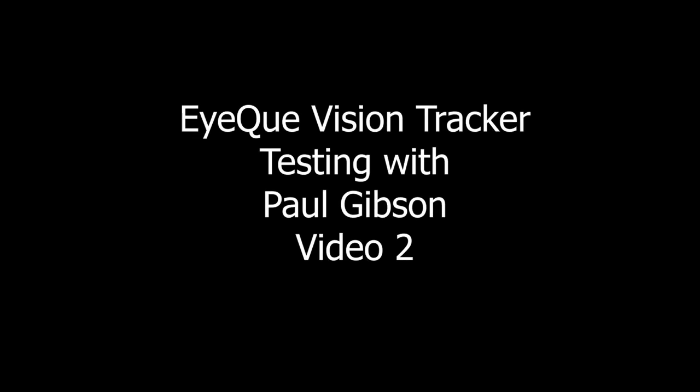Hi, my name is Paul Gibson. In this video I'm going to be taking you through the EyeQue Tracker device, the app, and you'll see me performing the test and then I'll talk about some of the results.